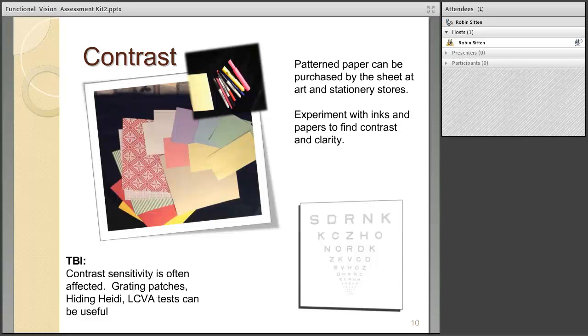Pack a few of each kind and keep the full pack at your home base. Replenish as needed. These small items like pins and post-its can be bagged together within the kit.